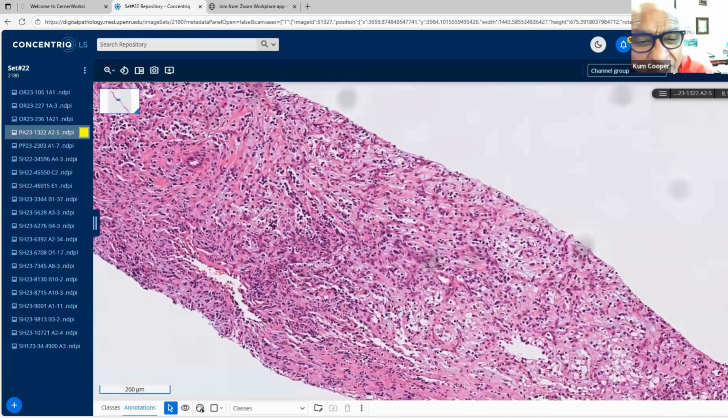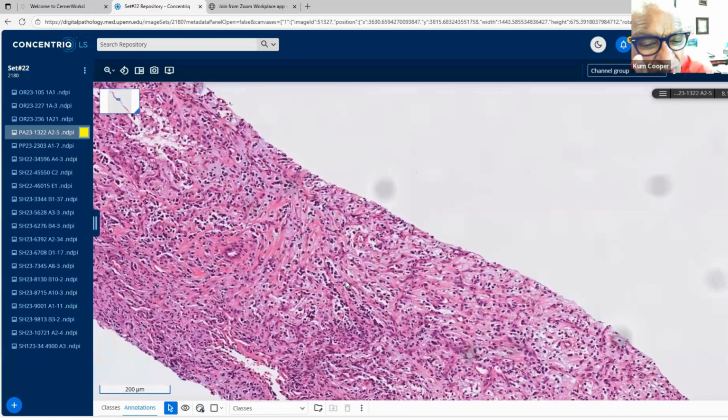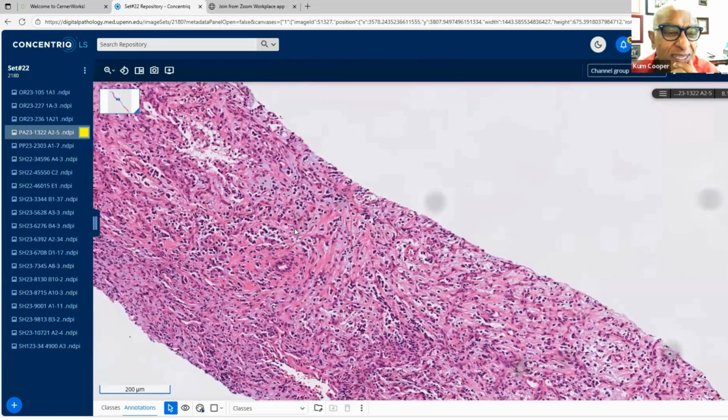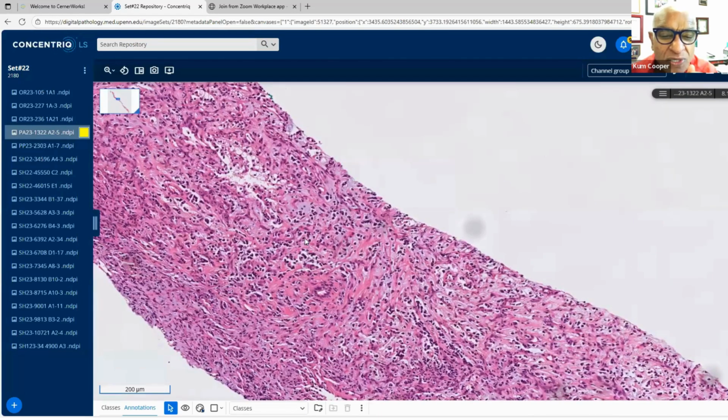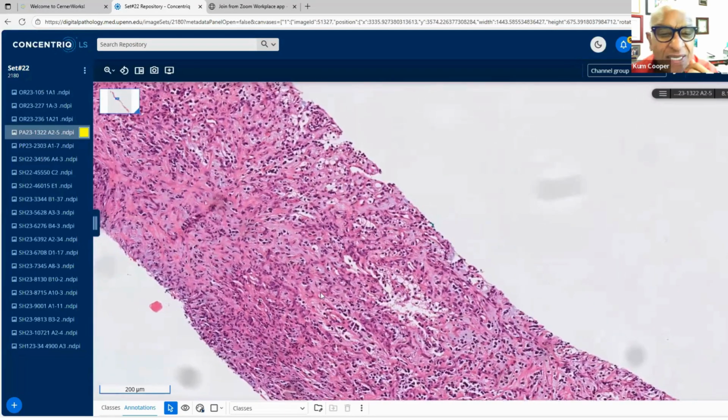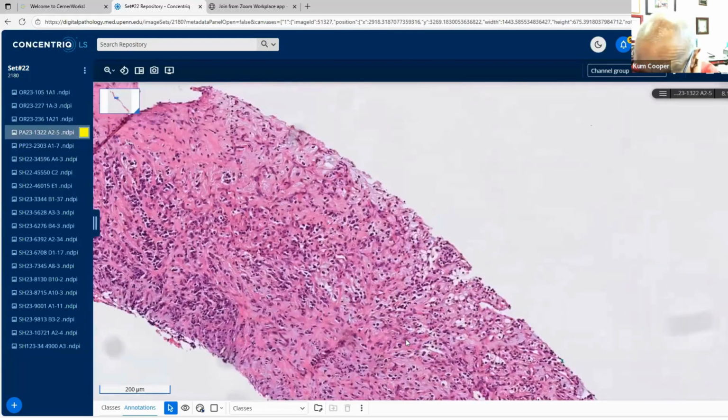This will come up. There is another perinephric myxoid mass that Dr. Fulp described. So don't confuse that with this one. The one that Dr. Fulp describes is around the kidney. It's a perinephric mass, and it's similar in morphology with this myxoid material and vessels and inflammatory cells. But in that context, you have to rule out dedifferentiated liposarcoma, so MDM2 is mandatory in that context. This now is in the renal sinus fat. And one of the things of this paper where they talk about this pseudomyxoma or pseudo fibromyxoid tissue is that many of these are associated with carcinomas.